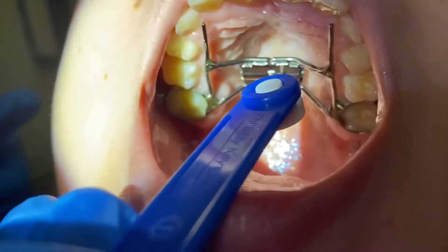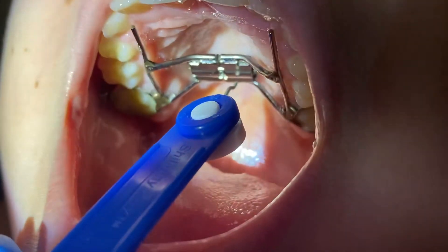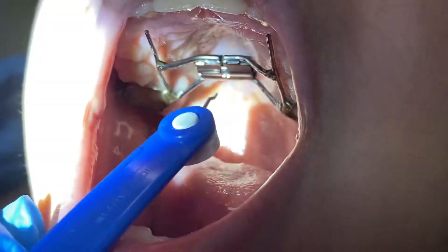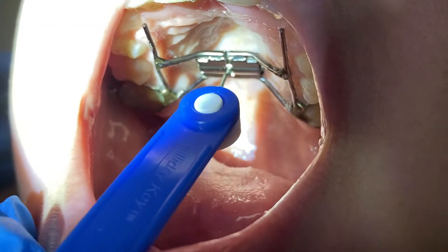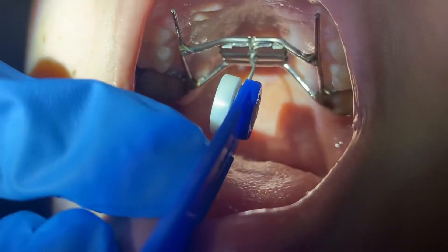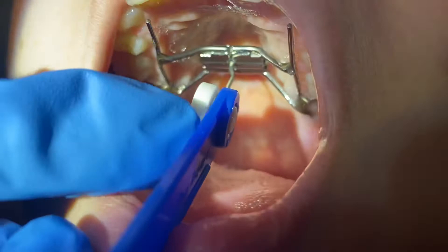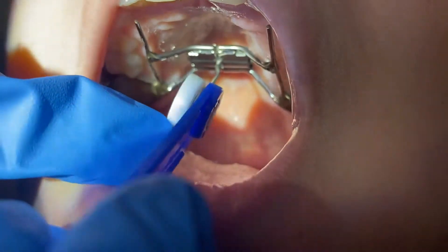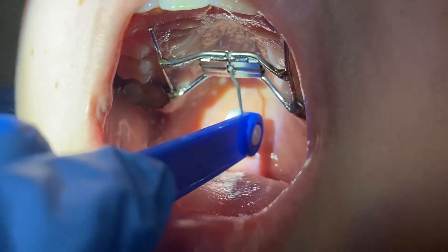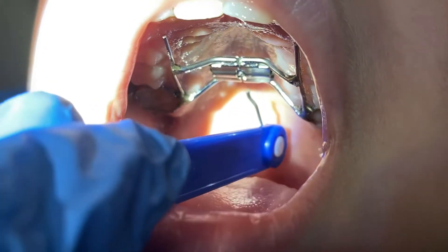We have the screw, and the direction of turns is showing the arrow to the back. This is the little opening — the little hole where we put the screw. You can see that this is 180 degrees between the little metal part and the plastic part. I'm turning it towards the back, towards the throat.